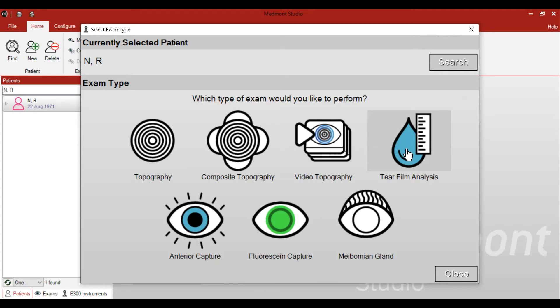The next test is called the Tear Film Surface Quality analysis. Instead of assessing the shape of the eye, it evaluates the fluid on top of the cornea — how smooth it is and at what point it breaks up. This is the way to perform non-invasive tear film breakup time testing.